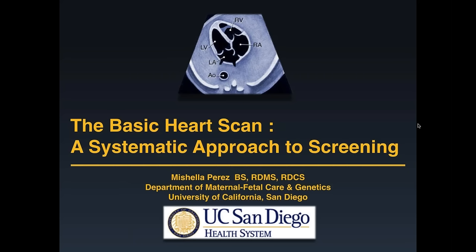Okay, and here we have someone asking to define the septum depth. So the septum, as you can see just looking at a normal model of the heart, pretty much covers a good amount of area, and it's a very curvilinear surface. When we do an ultrasound, like in the four chamber, the way the beam transects the heart, we're only covering a small portion of the heart. In order to thoroughly evaluate the septum, you want to scan anterior to posterior through the heart to be able to cover the septum. All right.